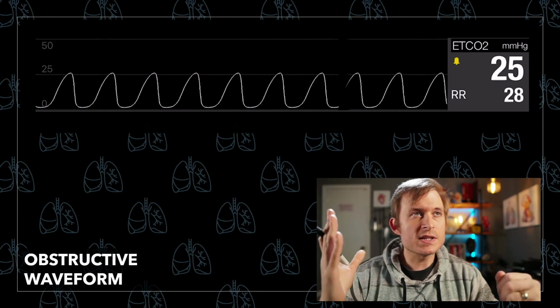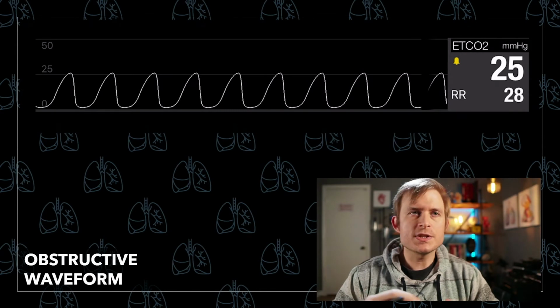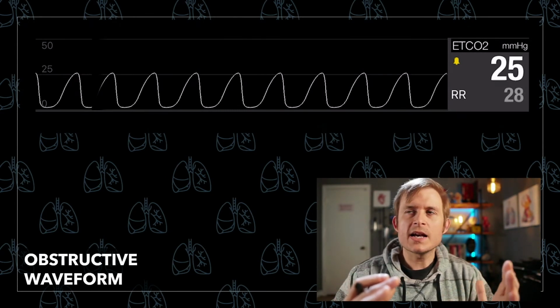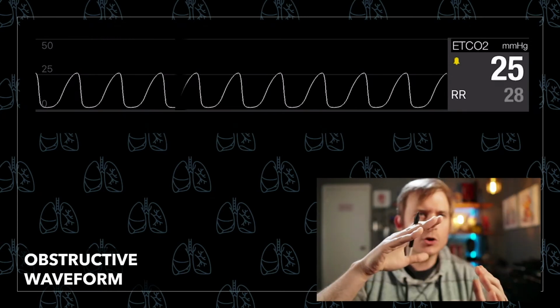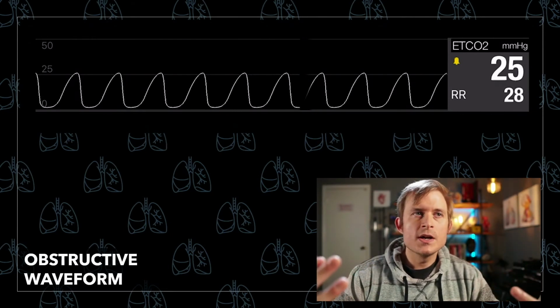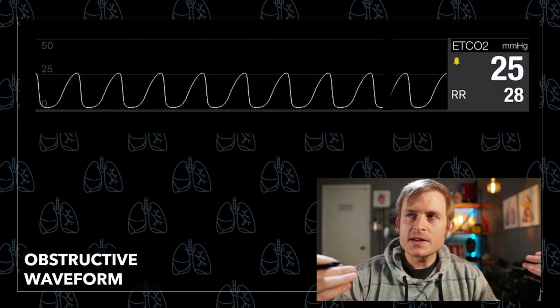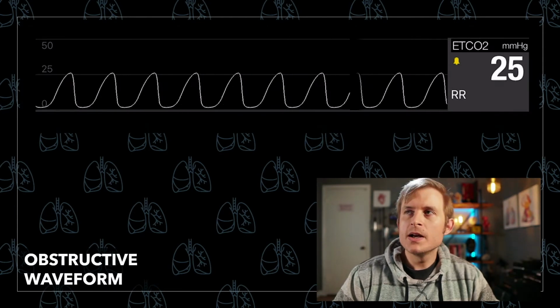And this is an example of a more severe asthma event. As you're seeing, the waveform is becoming more curved. And as this progresses, sometimes the inspiratory phase can be prolonged as well, and you can have a curve on the opposite end. But traditionally, asthmatics, when they begin to wheeze, they wheeze with expiratory wheezing first, and then as the event begins to become more severe, if it's not treated, you can then develop inspiratory wheezing as well.